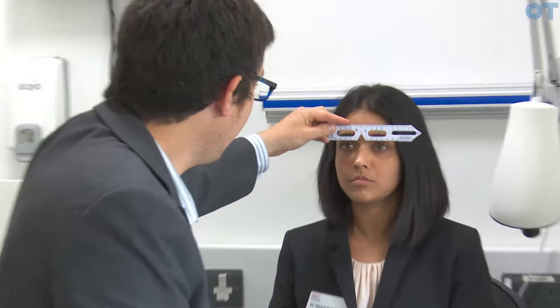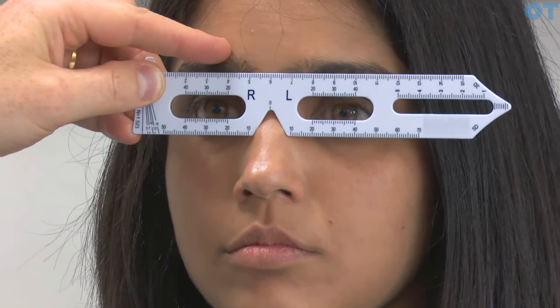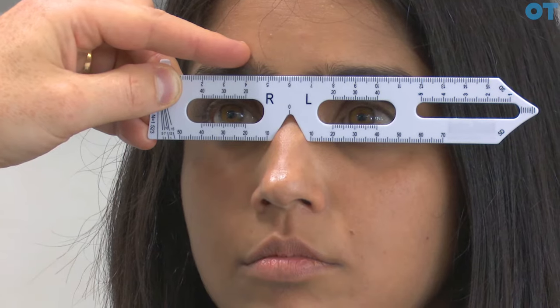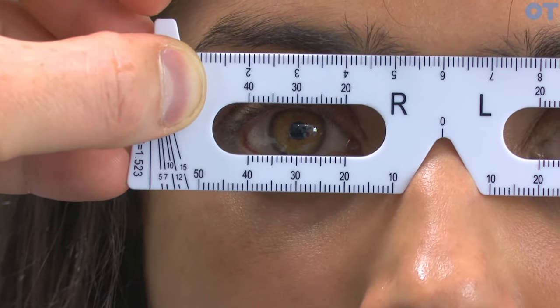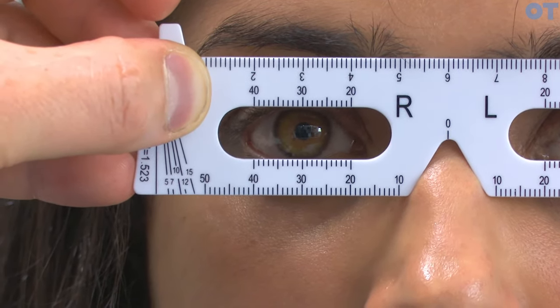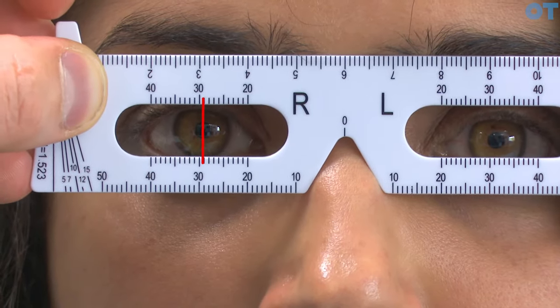We're going to measure monocular pupillary distance using the center of the nose as our reference point. The setup is the same as for binocular pupillary distance. We get the patient to look into my left eye whilst we stare at their right eye, measuring the distance from the center of the nose — where the zero is on the ruler — over to the center of the pupil.